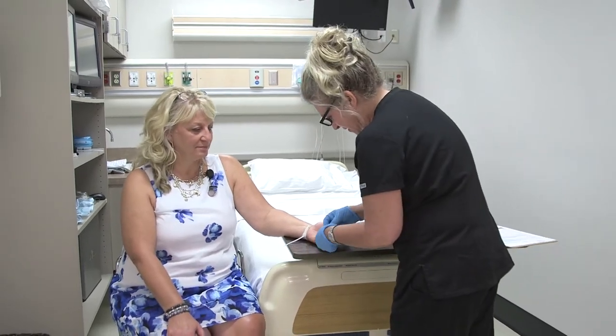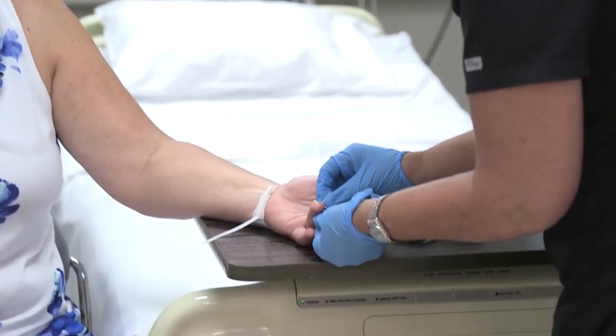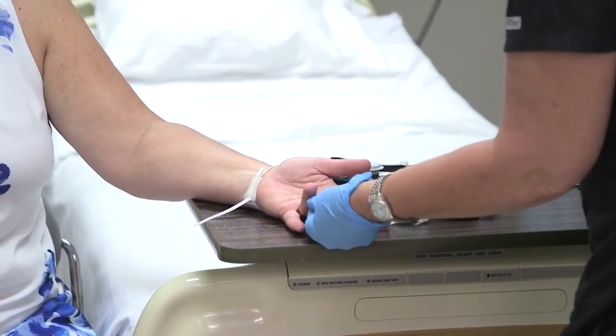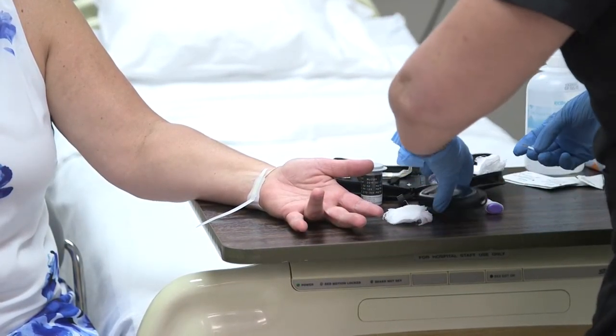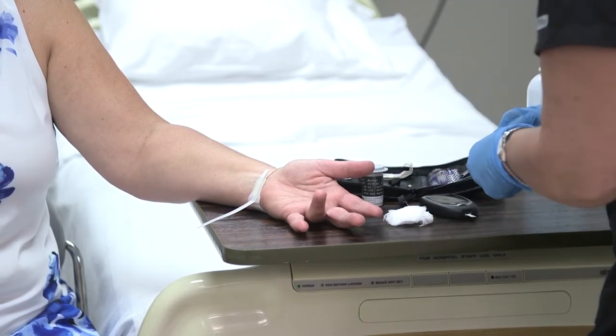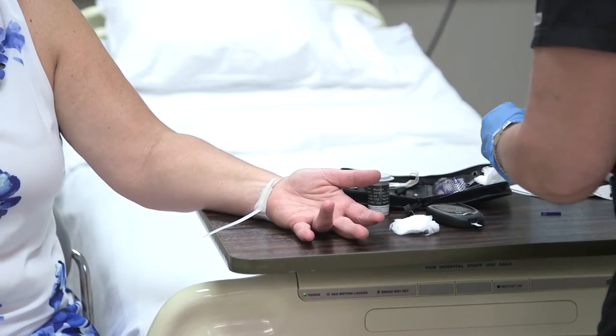All right, so we're just going to go ahead and cleanse that finger, and we're just going to make sure that it is completely dry before we puncture. Now I'm just going to go ahead and get the lancet ready.